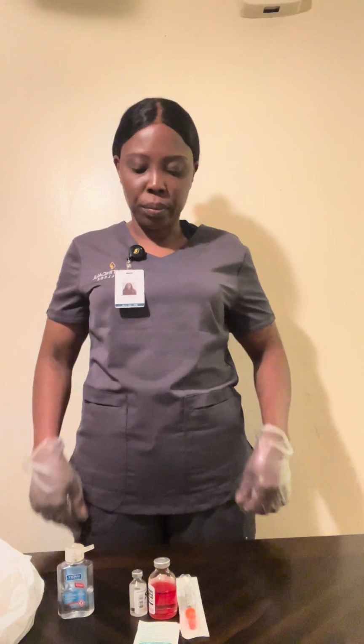I will have the nurse come to verify those numbers for me. Now I'm going to start rolling the vial between my hands to suspend anything and warm it to room temperature before I administer.